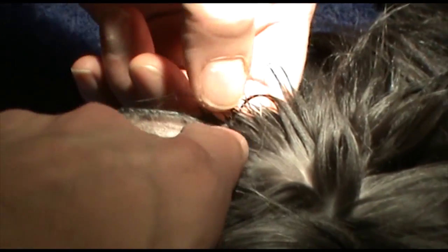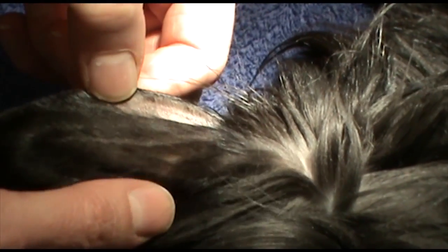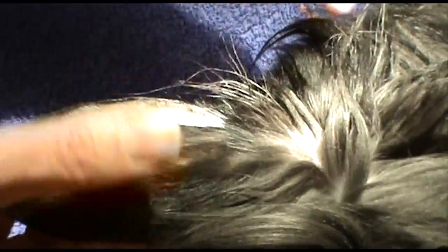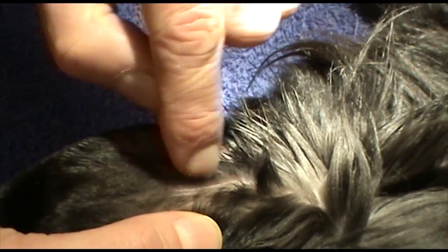You can just about see it standing up there. Because of the medetomidine, the peripheral perfusion is a little bit on the poor side. But this is the marginal vein that we use — there is one here you can use. The artery actually runs in the middle here, which obviously you avoid.